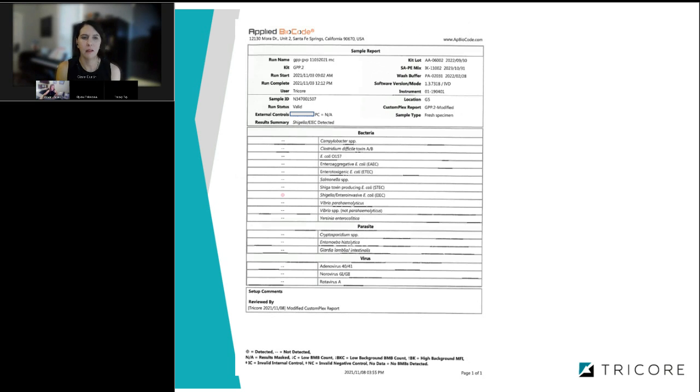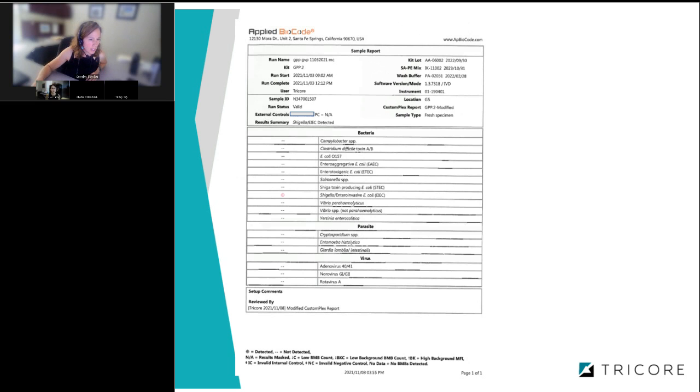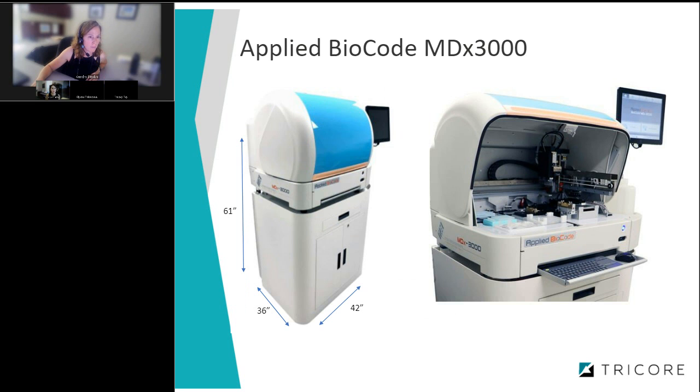It does not. I can actually bring up the picture of it, and maybe we can look at some of the components that get loaded onto the instrument. So this is the picture again. Hopefully you can all see it. So there are 2 racks of tips in here, and it actually uses by column. So if you have 3 columns of testing, it'll use 3 columns of the tips in the back. For the larger tips, it uses 3 columns no matter what.